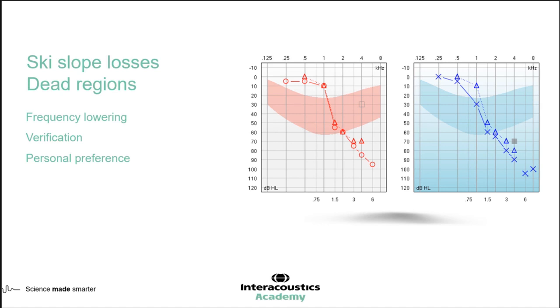It's obviously not the recommended procedure, but for him, he was much happier with an audiogram that essentially mimicked much better thresholds in the high frequencies, and he was then happier wearing his hearing aids. And in that instance, it was very much a case of it's better that than nothing. So you can be quite creative with how you set everything up for an individual.